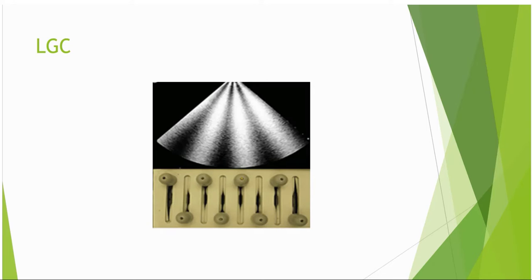Some systems have the ability to adjust lateral gains. This has the same effect as adjusting TGCs, but instead of depth gain being adjusted, the effect is upon a few lines of sight at various positions left to right across the display. This has the advantage when a structure partially covers the imaging field of view. To simply adjust the TGCs would increase the gain across those specific depths and potentially enhance ultrasound signals that did not travel through the offending structure. LGCs in this instance would best target resolving this problem.